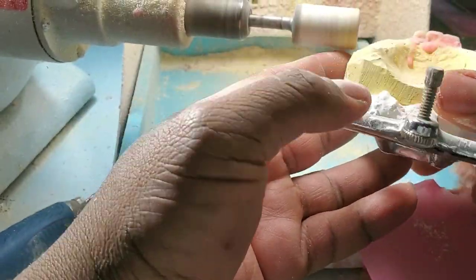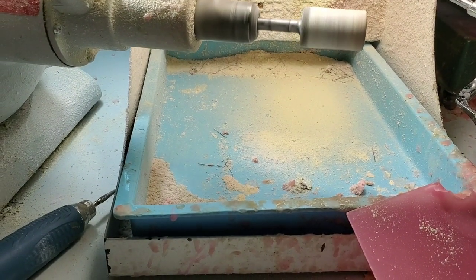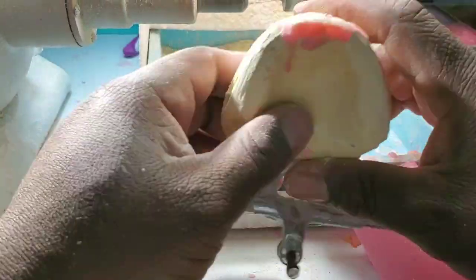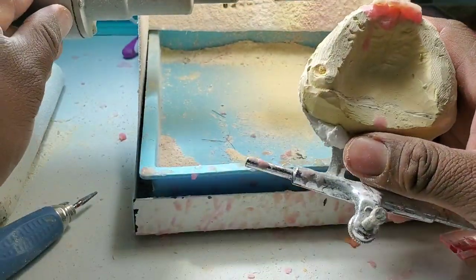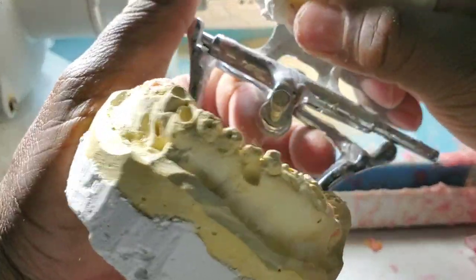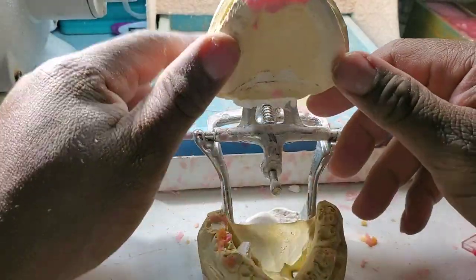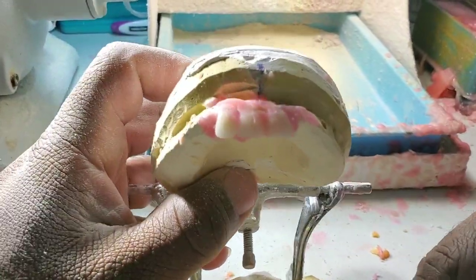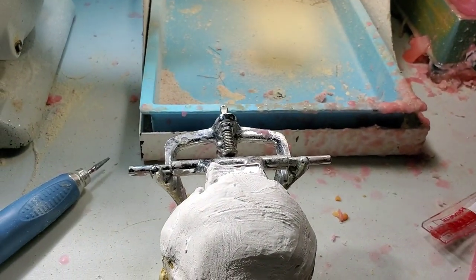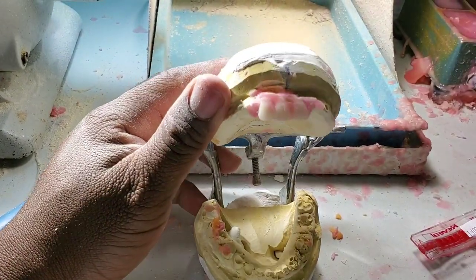That person has lost her vertical dimension because those teeth have been worn down to just about half. So I'm going to place all the remaining teeth on this top denture. I'm going to push this away from me so I can have space to work on this denture. I'm going to put another tooth — my lateral.